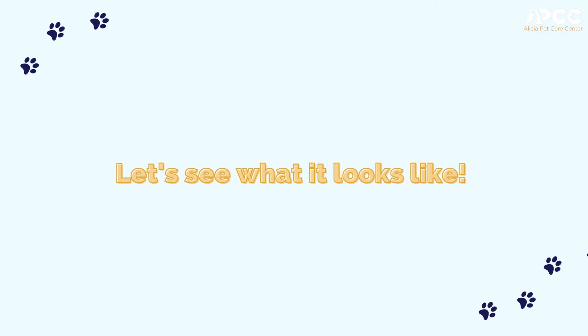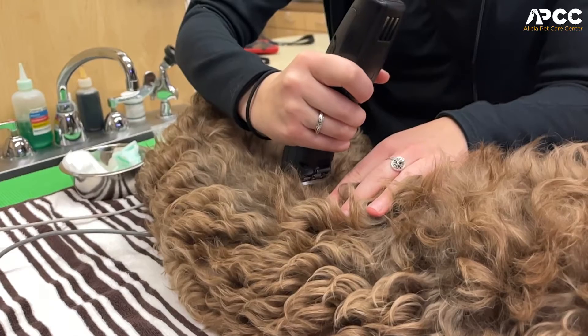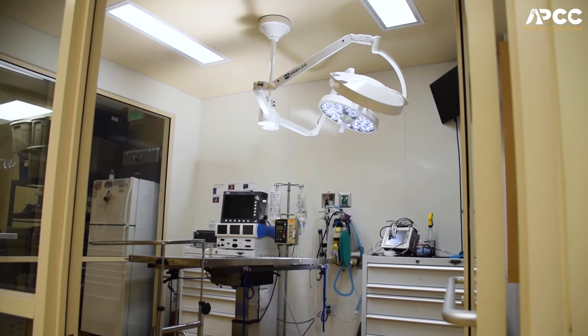In a laparoscopic spay, it is a sterile procedure, so the patient is fully anesthetized and sterile prepped for surgery. We completely gown, glove, and scrub for surgery, and then we come into one of our OR rooms.